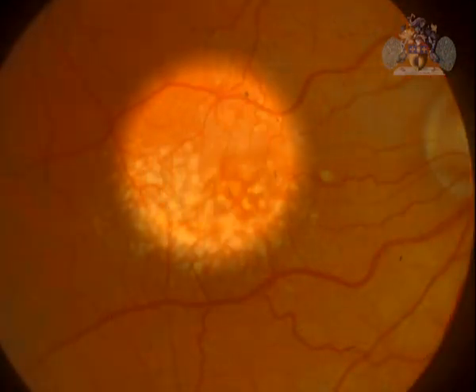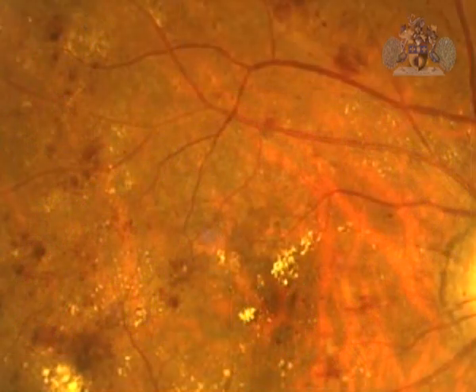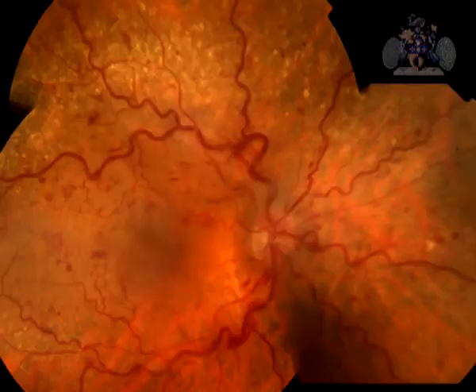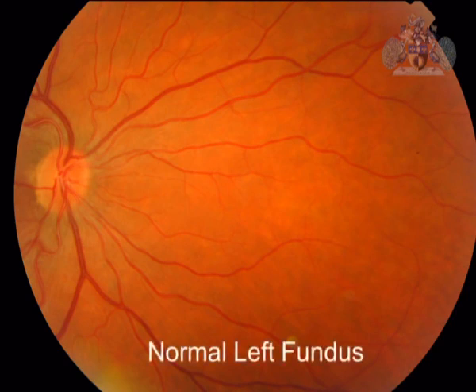Clusters of pale, creamy lesions in the centre of the macula, with the rest of the retina looking entirely normal, would suggest drusen. Atrophy, laser scars. Red lesions would be suggestive of hemorrhages: dot, blot, flame-shaped hemorrhages, boat-shaped or pre-retinal hemorrhages. Abnormal vessels may be new vessels or tortuous or dilated vessels. As a novice, it is important first to distinguish normal from abnormal, and then to practice and gain experience over time.